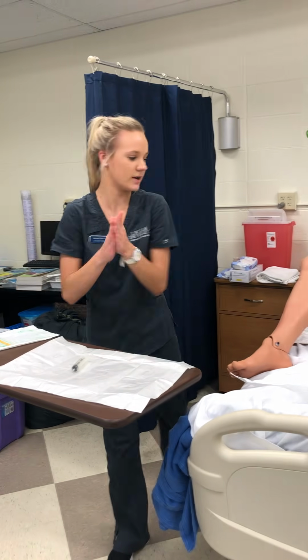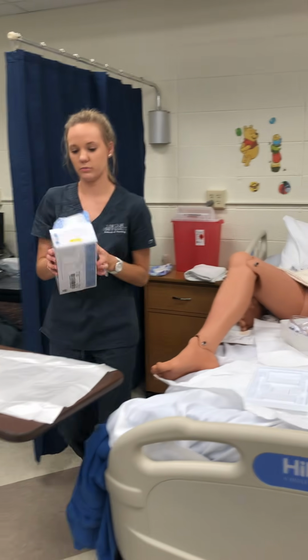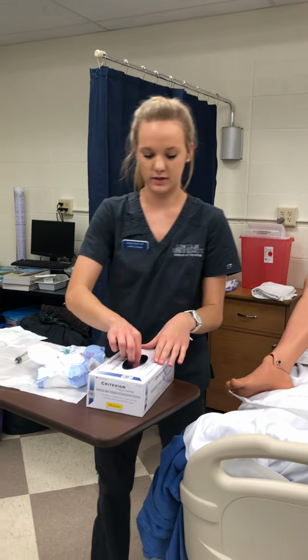So in real life, I would have betadine everywhere, so I'm going to go ahead and clean that up with my wipes and gloves.